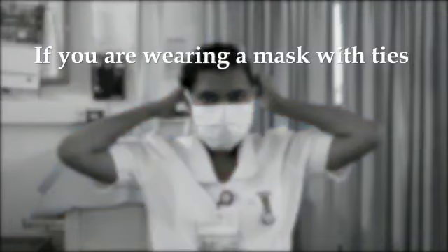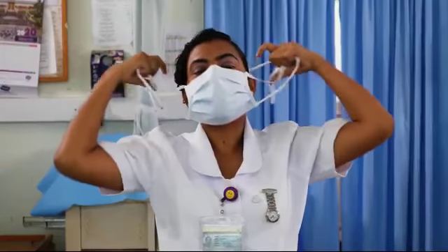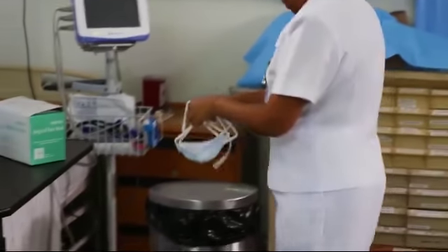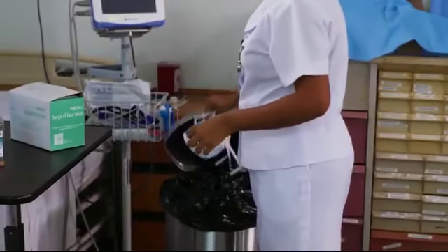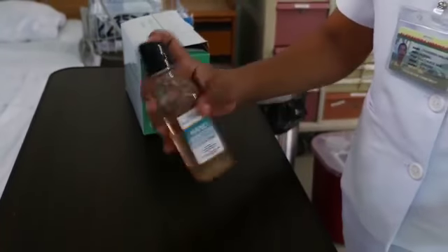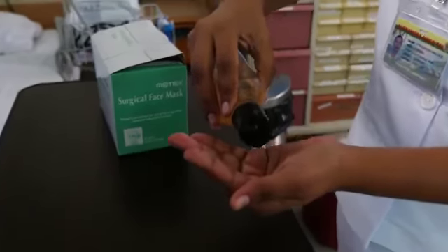If you're wearing a mask with ties, untie the bottom bow first, then untie the top bow and pull the mask away from you as the ties are loosened. Throw the mask in a covered trash can. Clean your hands with soap and running water or hand sanitizer.